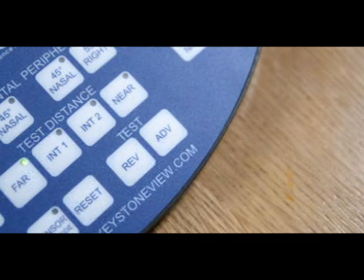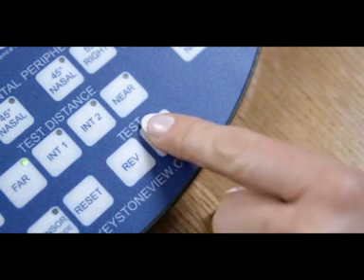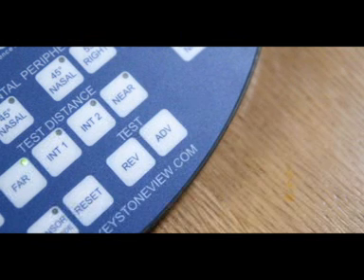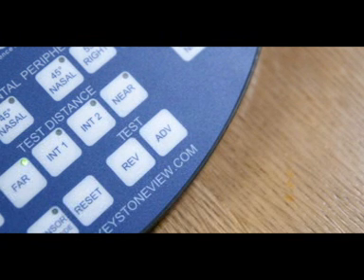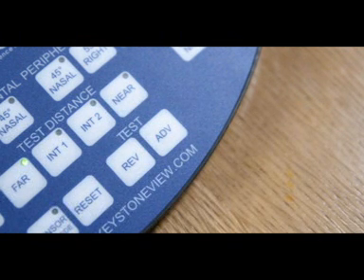Press the ADVANCE key to move to test F7. This test measures far point stereopsis or depth perception. This test consists of rows of symbols. In each row, one symbol should appear to stand out in front of the others. Give the patient some time to adjust and then begin by asking which symbol sticks or floats out, or appears closer than the others in the top row.